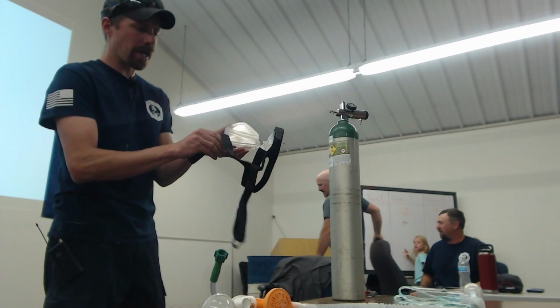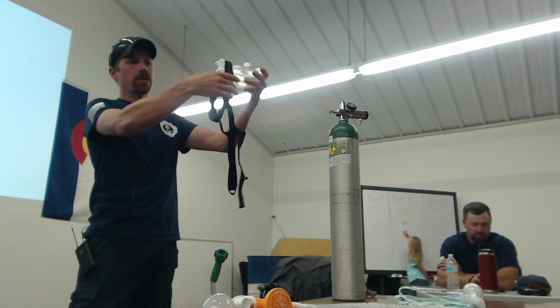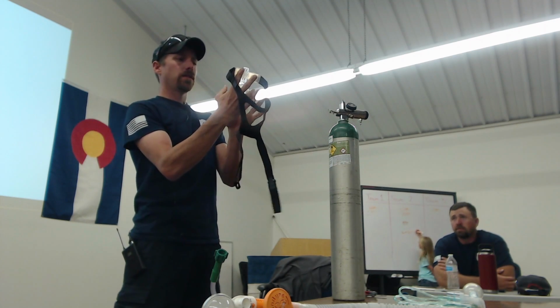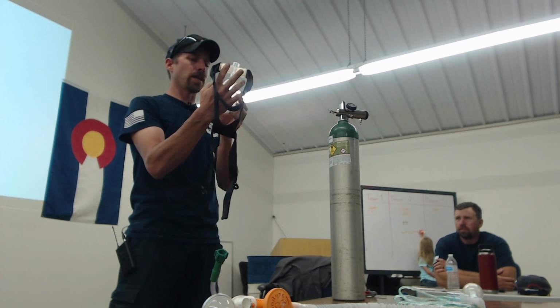So when you pull this mask out of the bag, it's going to be in this configuration. It will be attached to the top, already Velcroed down, and it will not be attached to the back. It's got this forehead piece that you don't want to put in their eyes, obviously. So you're going to want to get that up on the forehead to help stabilize this whole thing.